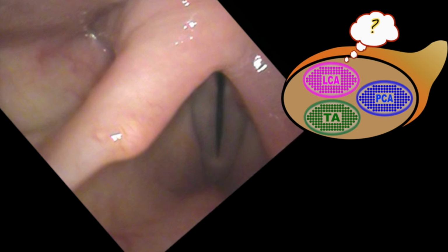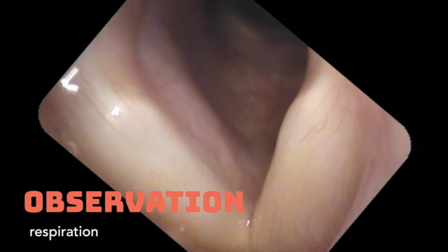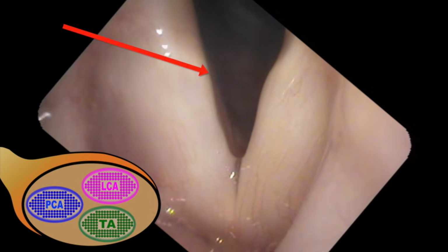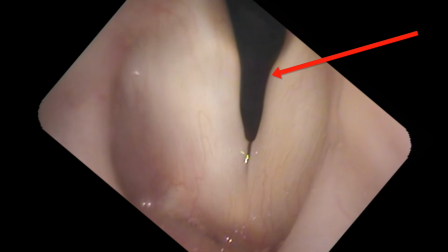All right, what's going on here? Another case. Well, let's watch respiration. Compare the two sides. We can see one side, the right side, moving through a certain range, and we'll call that normal compared to, let's say, the left side, which is moving in the right direction each time, but through a very, very reduced range.